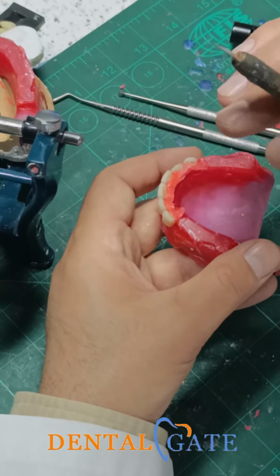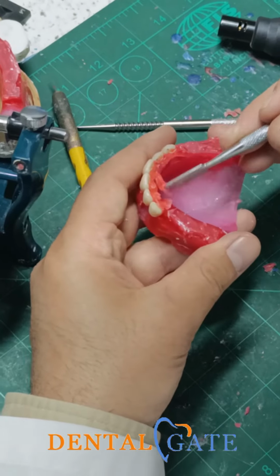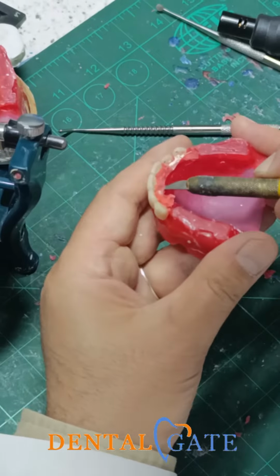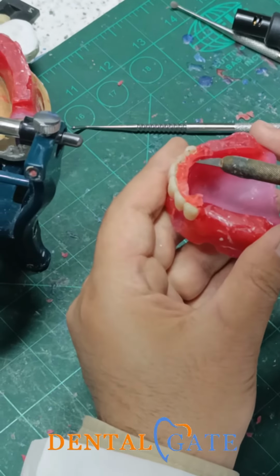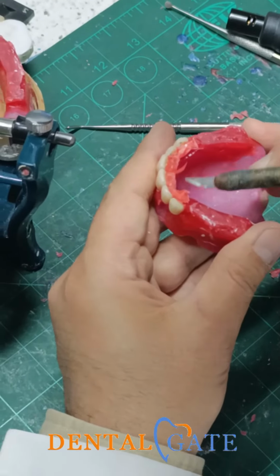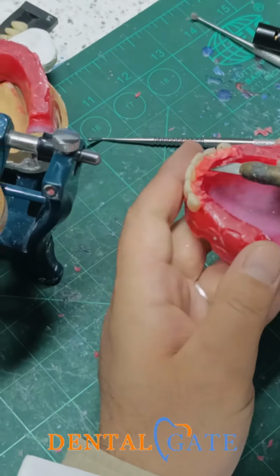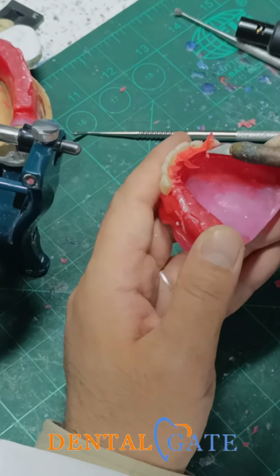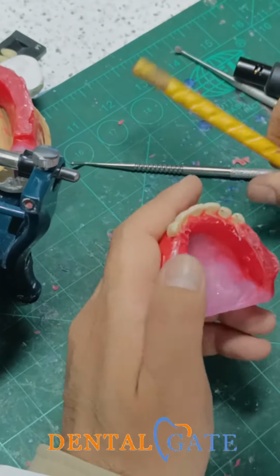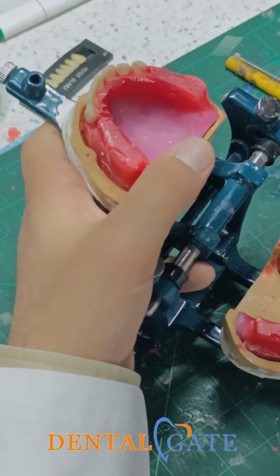The cingulum and all features of the lingual should be clarified within the wax, okay? So remove the wax to avoid the compromise of your sight when you work. Remove the wax, but be sure not to push the teeth and alter the normal position. Remove all wax from the lingual aspect to provide good sight, because I will make a check of the lingual aspect, because I have the overjet and overbite.